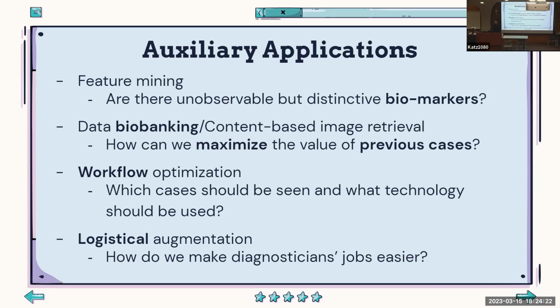And so if we're able to train a model to identify which features are most diagnostically relevant, then we can construct much better decision matrices for whether or not a certain pathology is dangerous or not. A really good example of this, if you want to check it out, is a famous package developed by a team at Harvard called PyRadiomics. They created a Python package that extracts all these strange, weird values from MRI images.